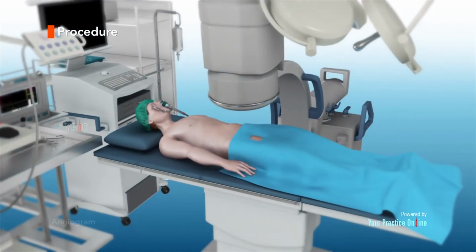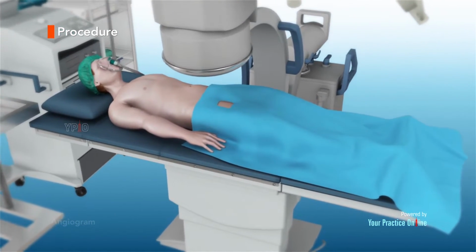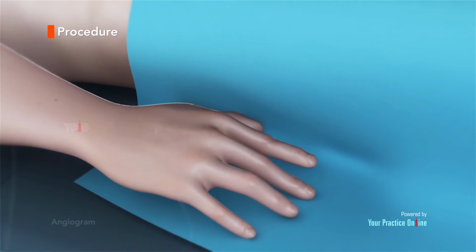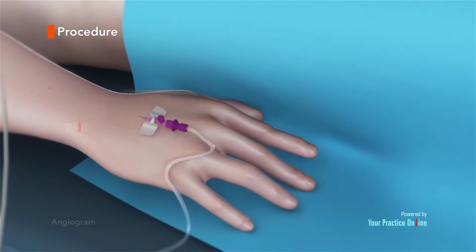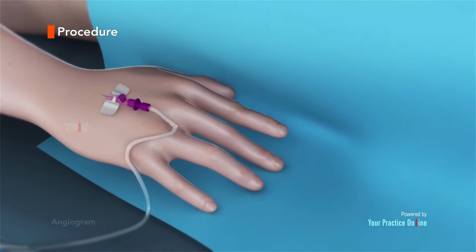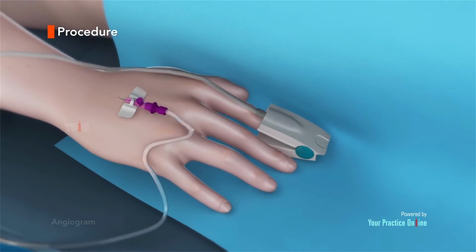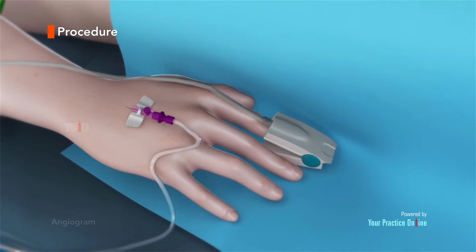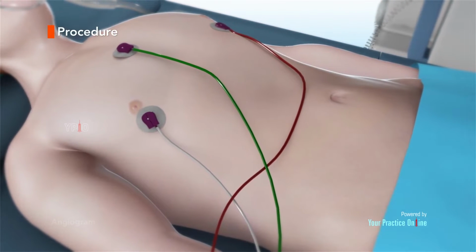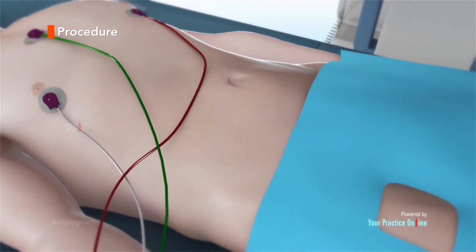Procedure. The following steps are involved in performing an angiogram. You will lie on your back on an X-ray table. Your doctor will insert an intravenous line in the vein of your arm to provide the required medicines and fluids. A pulse oximeter will be placed on your finger or ear to measure the levels of oxygen in your blood. Electrodes will be placed on your arms, chest, or legs to record your heart rhythm and heart rate.